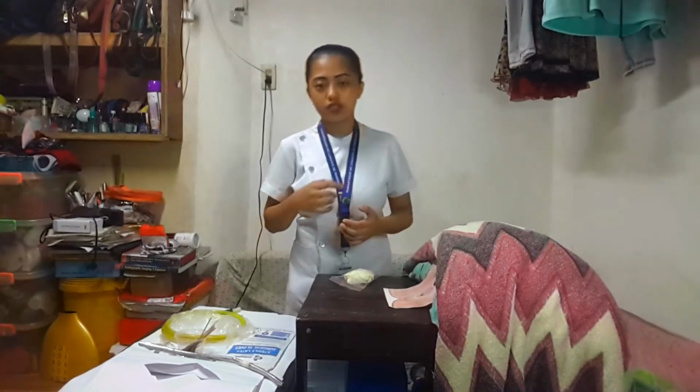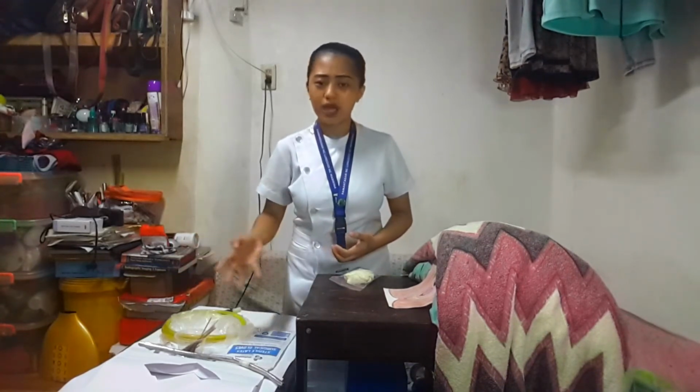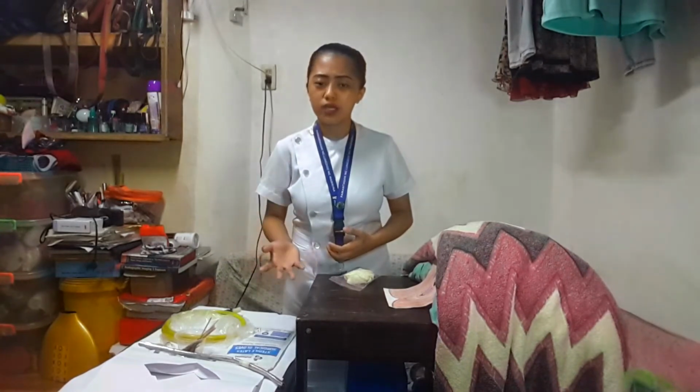After preparing all of this, we need to wash our hands and observe other infection control procedures. The rationale is to prevent the spreading of microorganisms. Next is to greet the patient and introduce ourselves. Also explain the plan and procedure to her and why it is necessary. The rationale is for us to verify if we're handling the right patient and for the patient to be aware of what we are going to do.